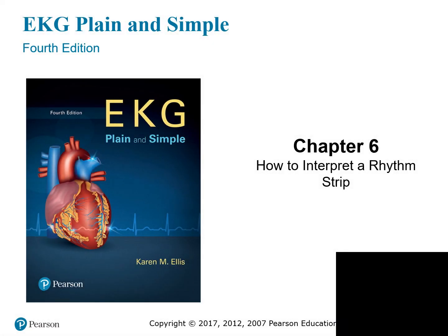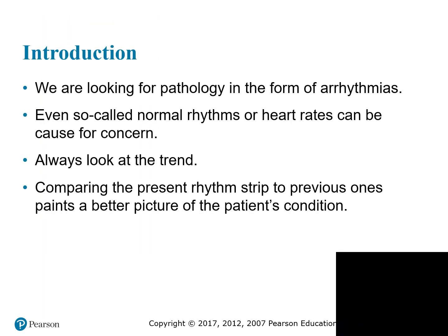Interpret a rhythm strip. What we are looking for is the pathologically in the form of an arrhythmias. Even so-called normal rhythms or heart rates can be cause for concern. Always look at the trend of a rhythm strip.